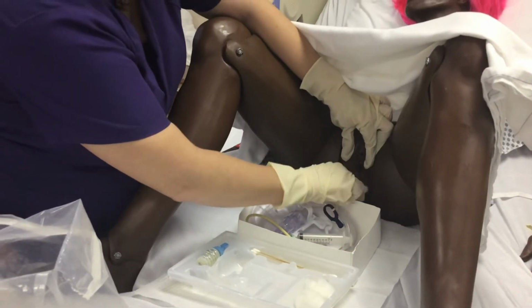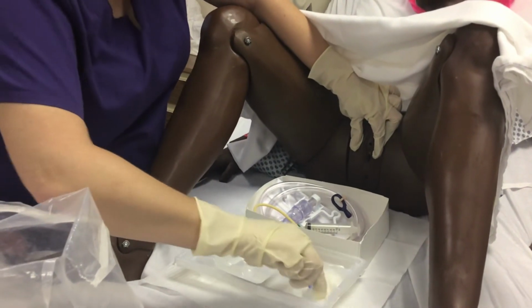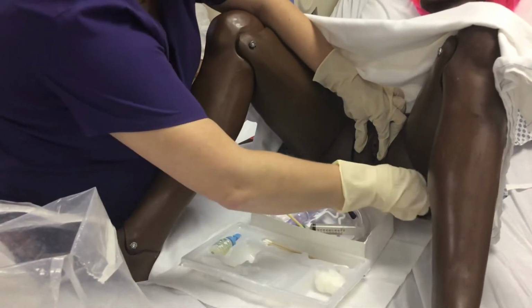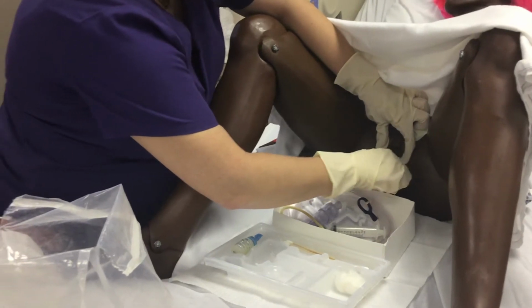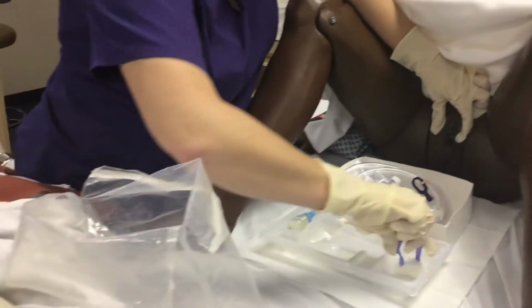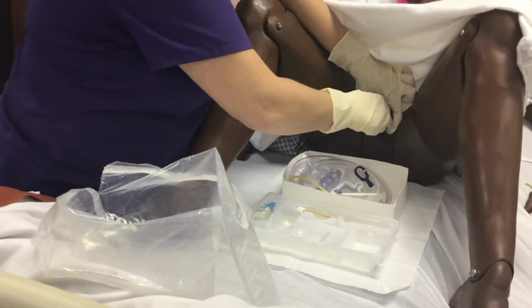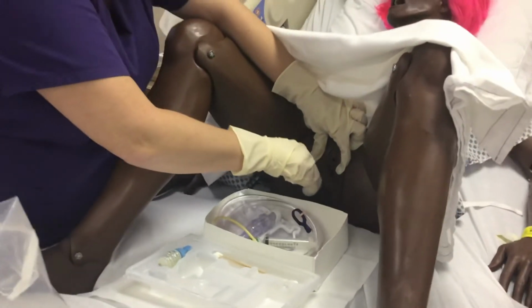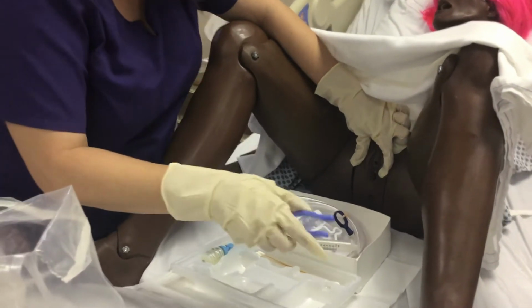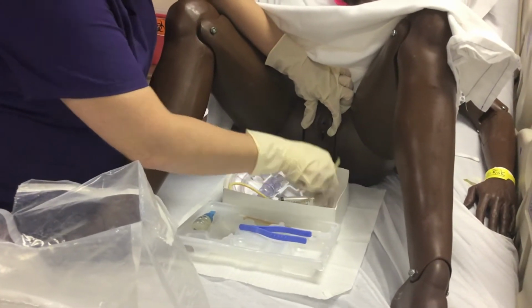I'm going to clean the middle first. And drop. Go around this way. I'm going to clean this outer part away from me next. And drop. I'm going to go this way, not touching your leg, and clean this part. One stroke down, all the way around, and drop. Okay. Now I'm going to insert the catheter.